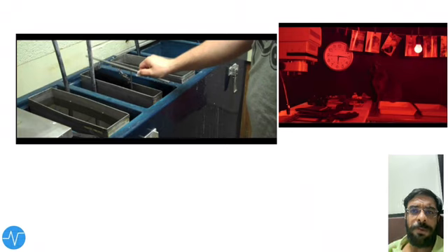There will be one container for development, one for rinsing, one for fixation, neutralization, and one for washing. Each process has to be done, meaning the X-ray needs to be dipped in the development container for some time, removed, put in the rinsing container, kept for some time, removed, then kept for fixation, neutralization, and so on.